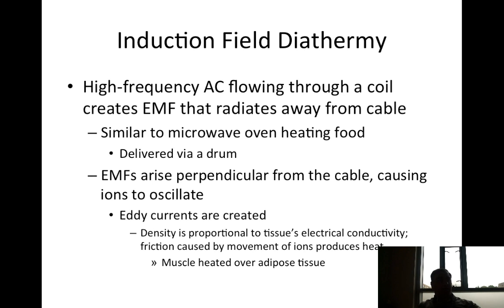Induction field diathermy. So with the high frequency alternating current, AC, flowing through a coil, it creates an electromagnetic field that radiates away from the cable. It's similar to a microwave oven heating food. You could actually technically cook some food underneath a diathermy unit.